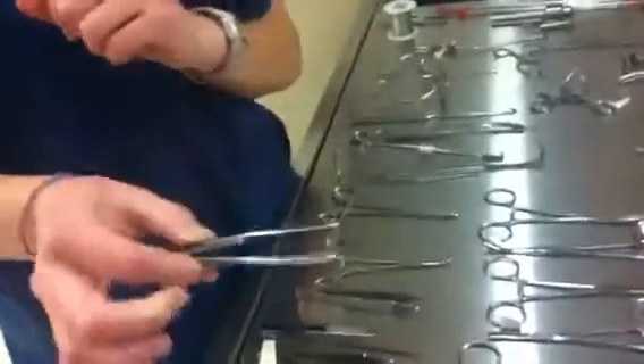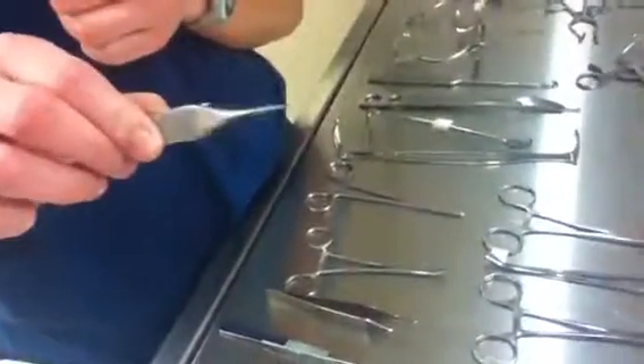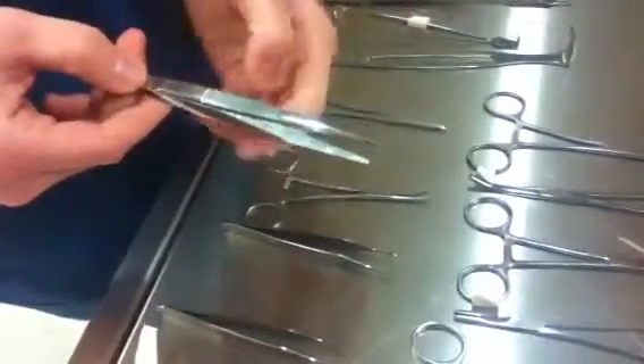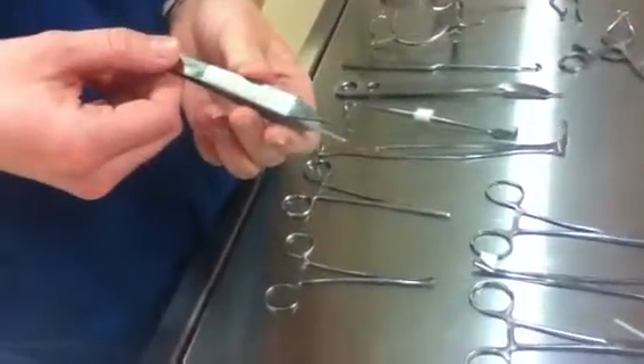This is the Russian thumb forcep. These ones are the Brown Adson. The dressing bandaged thumb forcep. Rat tooth. Adson, just the normal one.